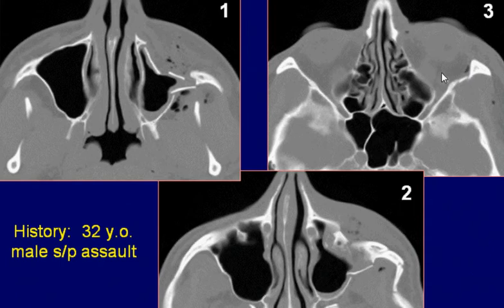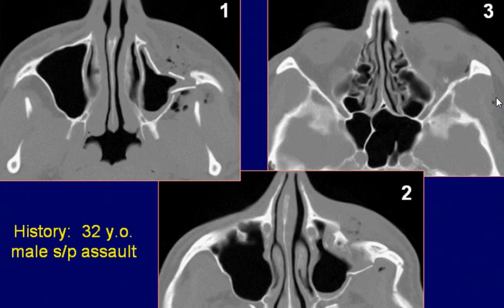A small bony fragment is seen inside the left orbit. There are small air pockets seen within the left orbit and adjacent soft tissues of the face.